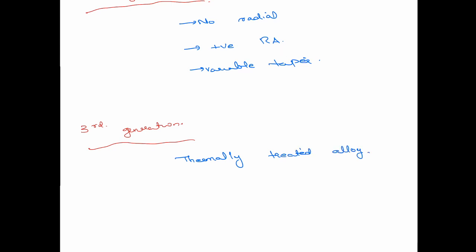This was manufactured, and the different thermal treatments which were given were named as M-Wire, okay. Then we had CM Wire, controlled memory, okay, CM Wire, so control memory wire, and then we have R-phase wires. Okay, so these are three different thermally treated wires. Okay, and basically you don't need to go into details of this.